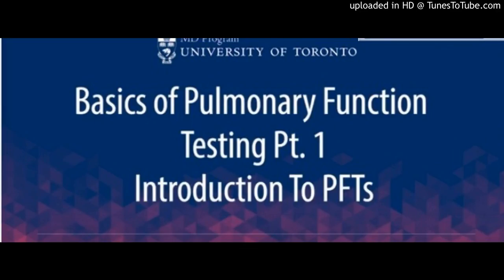The objectives of this lecture are to list 5 indications for PFTs, to describe 4 patient factors that influence predicted PFT values, and to discuss the methods for distinguishing normal from abnormal PFTs. Let's discuss the clinical indications for PFTs. Firstly, patients may present with symptoms such as cough or shortness of breath that are referable to the respiratory system, and we want to further investigate their lung function.